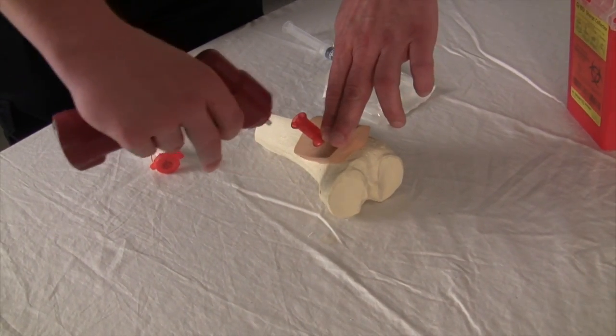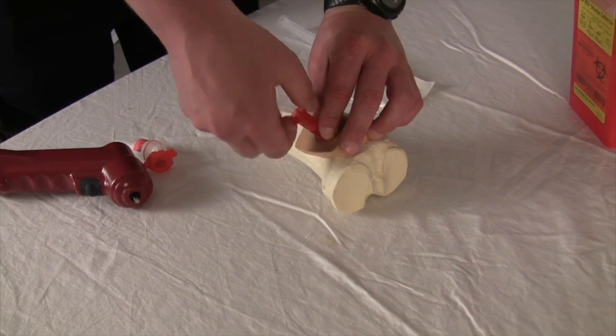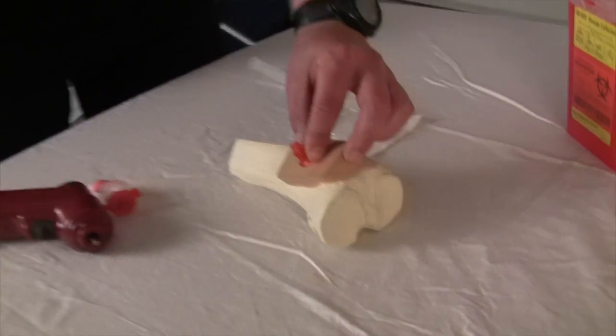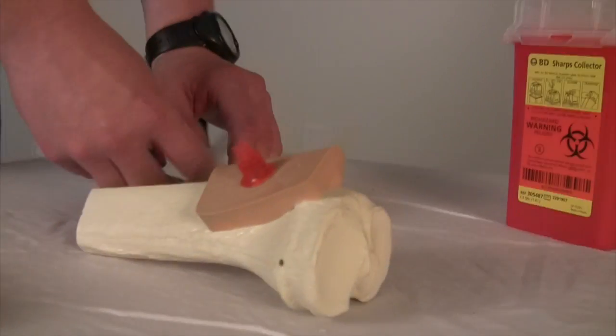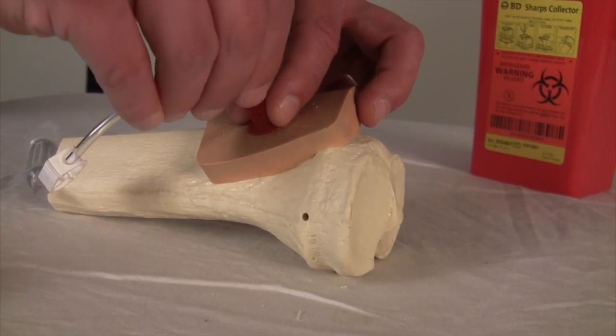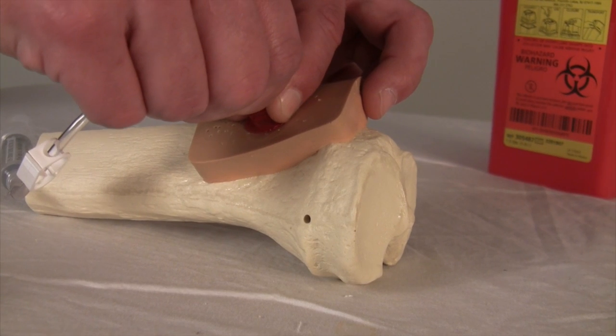If the needle is in place correctly, it should stand up, should not be wiggly, and should not require anything to keep it in place. The stylet is removed, and the end of the needle is a standard IV luer lock connection, which can be extended using IV tubing.